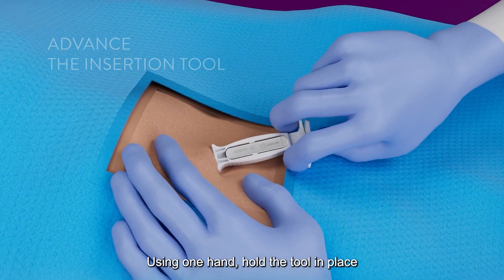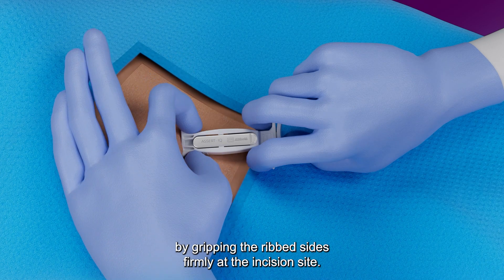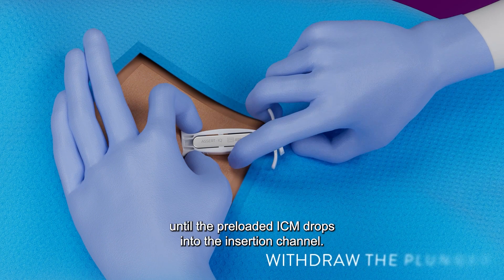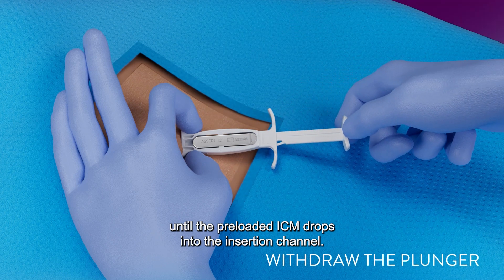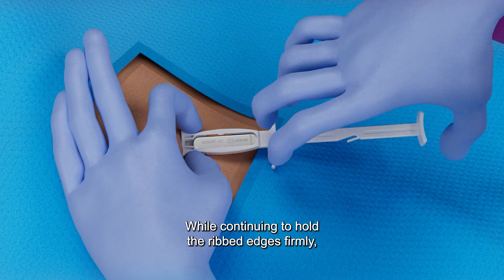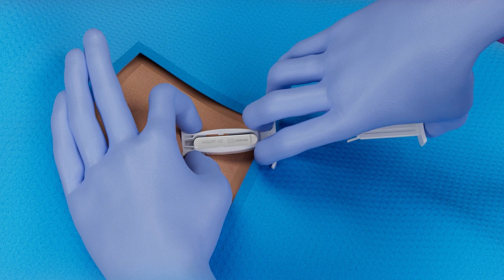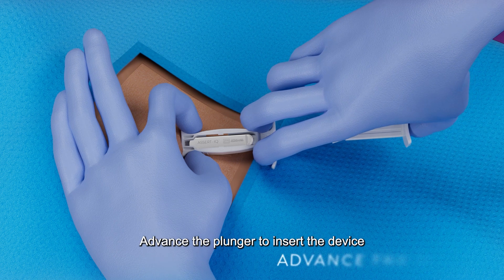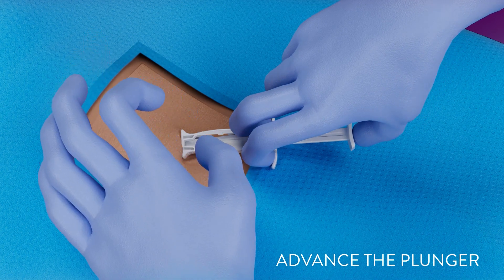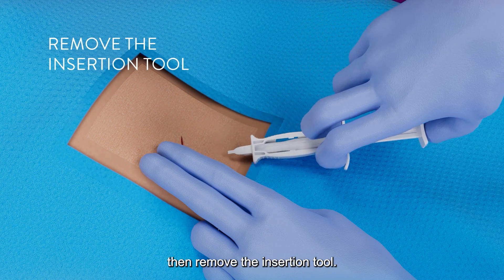Using one hand, hold the tool in place by gripping the ribbed sides firmly at the incision site. With the free hand, withdraw the plunger until the preloaded ICM drops into the insertion channel. While continuing to hold the ribbed edges firmly, use two fingers to grasp the wings and place a third on the plunger. Advance the plunger to insert the device into the subcutaneous layer. Apply pressure to the incision site so that the device does not move, then remove the insertion tool.